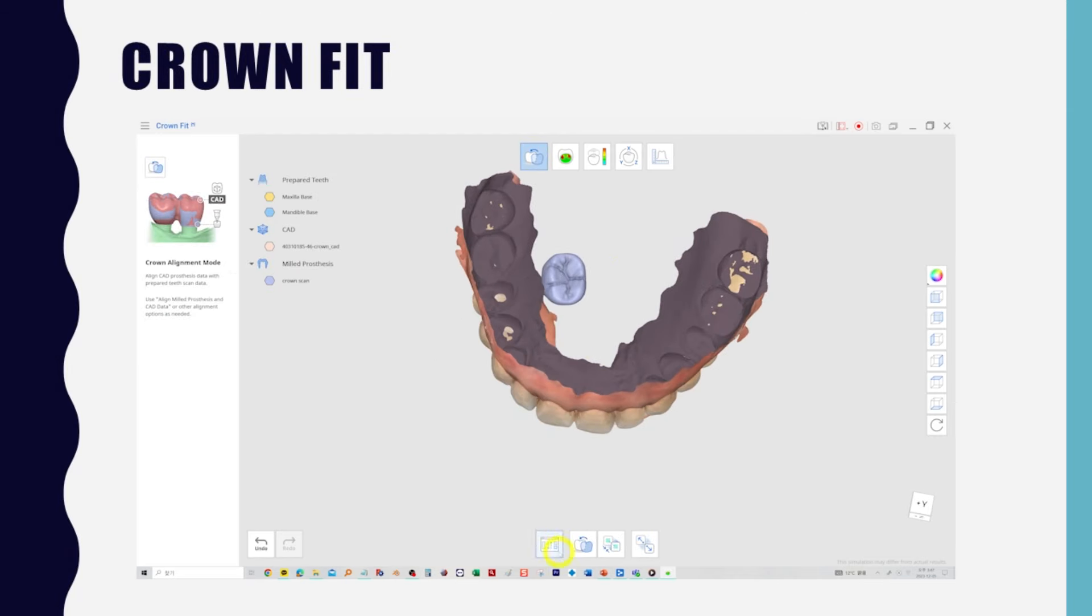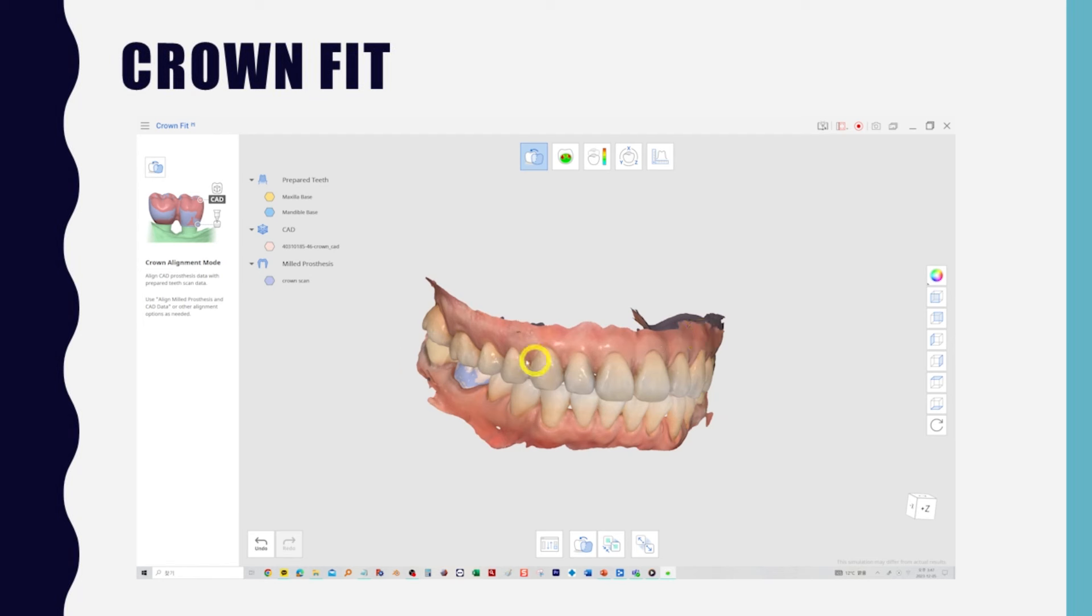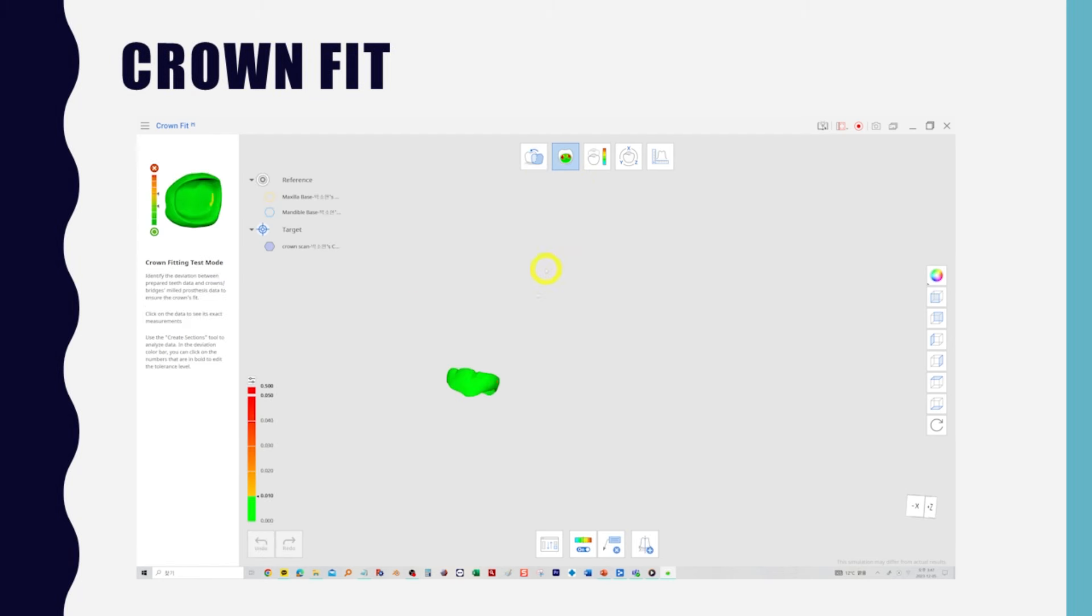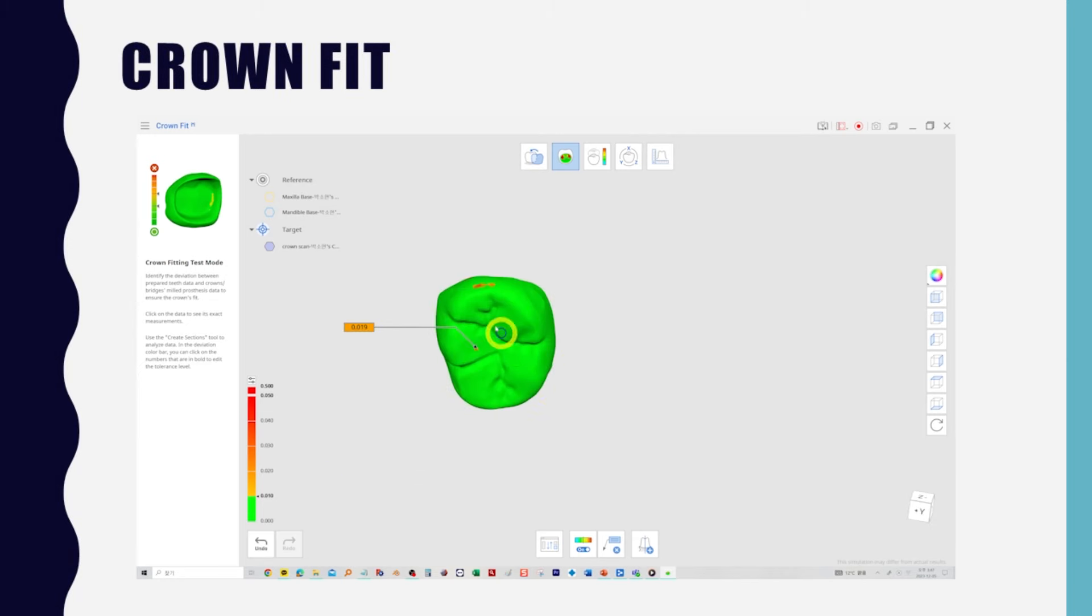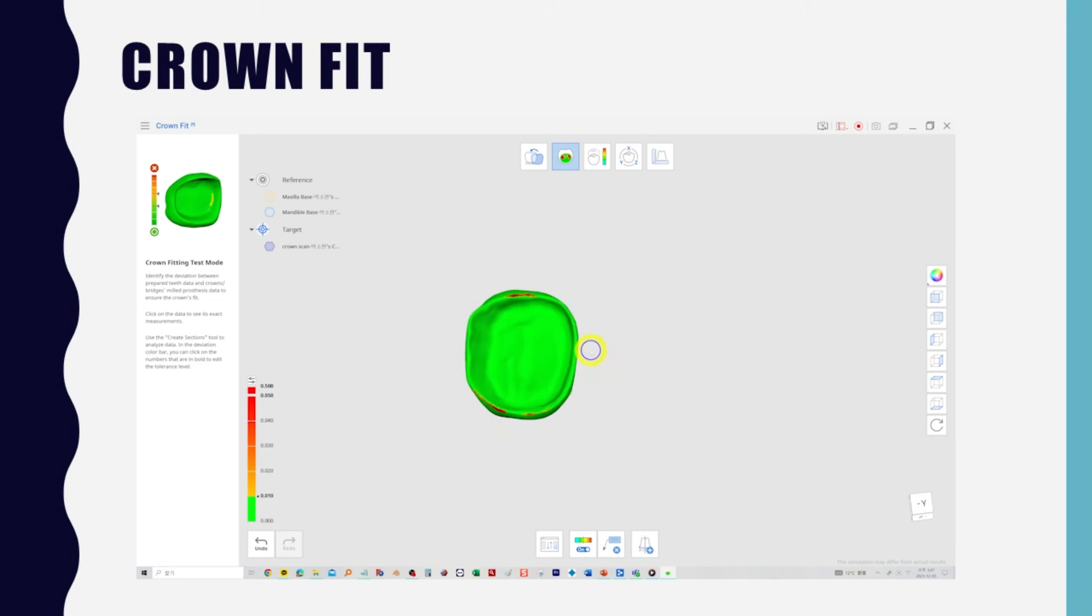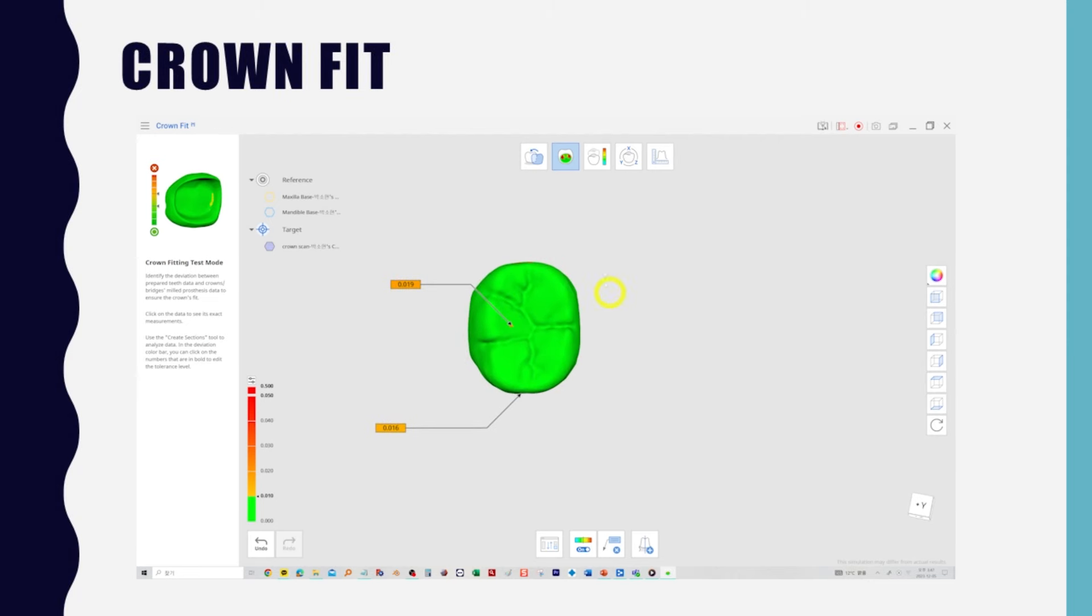Align the scanned crown to the design file using the crown alignment feature. This will show you where the inner and outer surfaces of the crown touch the scan file. This indicates the area and strength of the early contact on the inner surface and the adjacent surface, as well as the location and degree of occlusion.